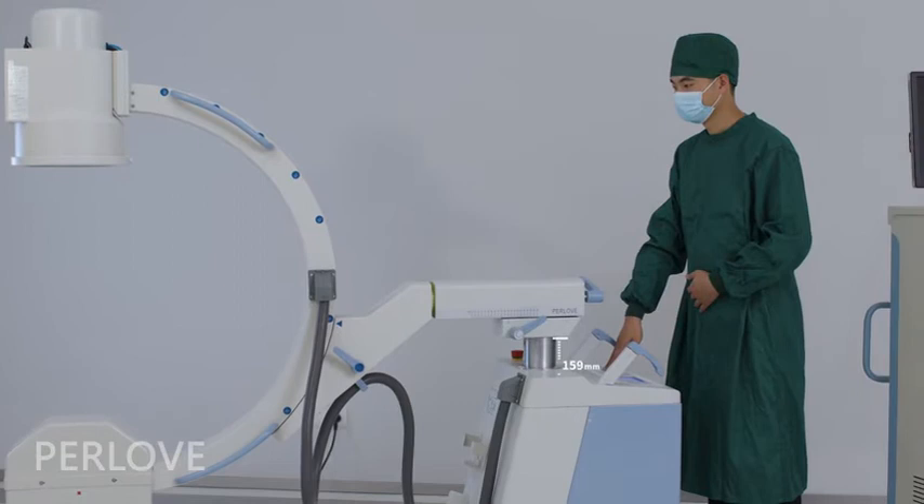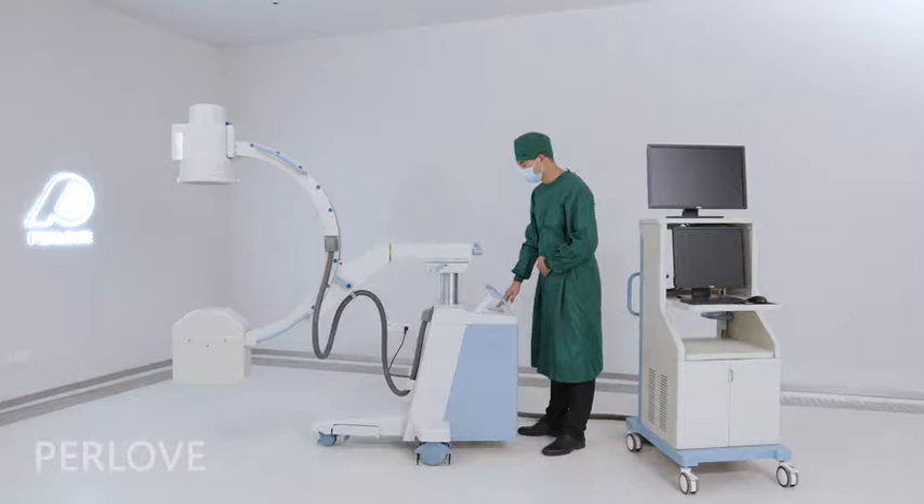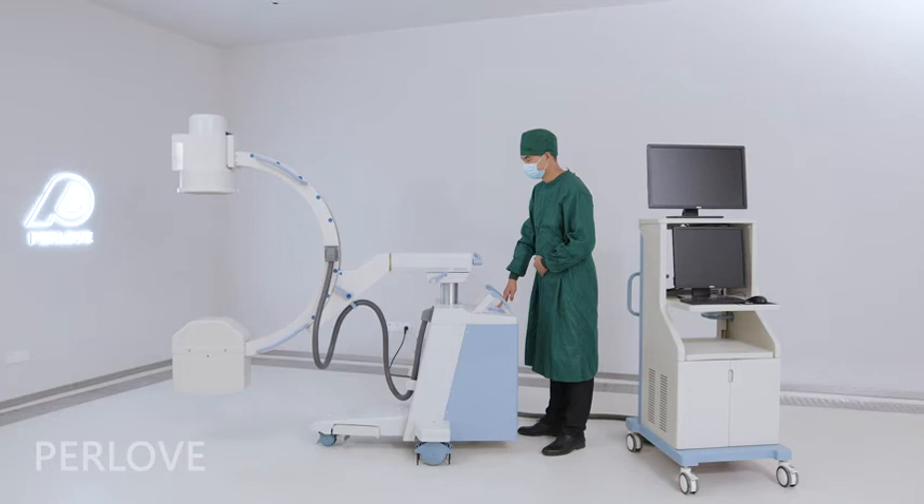When you press this button, the C-Arm electrical lifting range is 400mm. The compact, flexible mechanical movement design can meet different medical needs and provide a comfortable control experience for doctors.